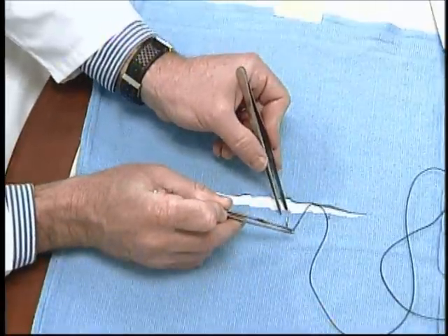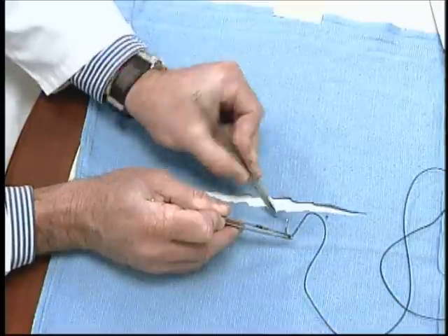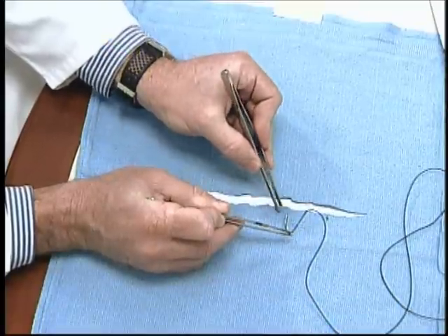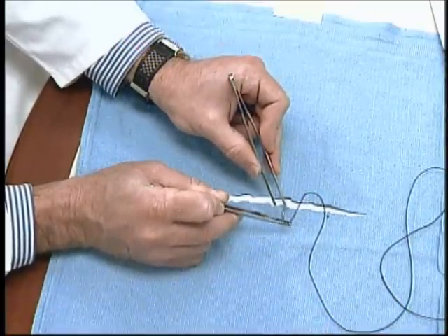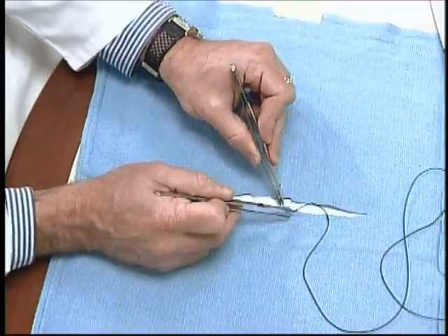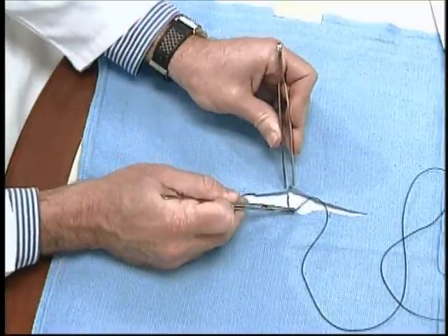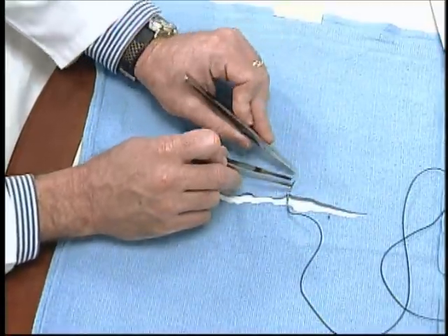Passing the needle through in microsurgery does not involve picking up and squeezing the tissue, because this will oftentimes crush it. We simply insert the forceps underneath and exert some pressure so that we can pass the needle in an atraumatic fashion.